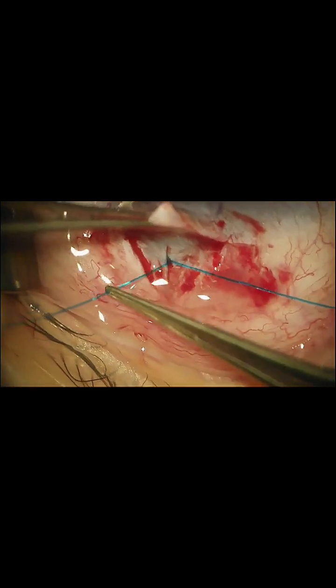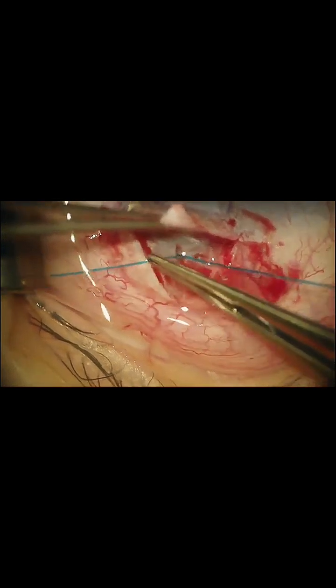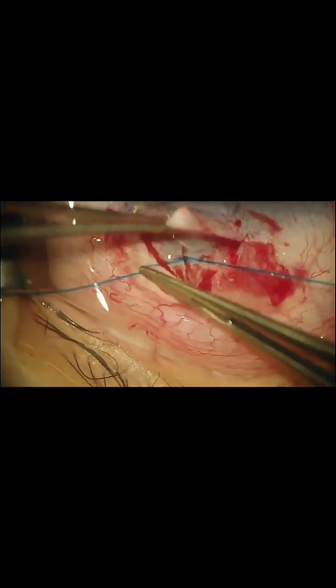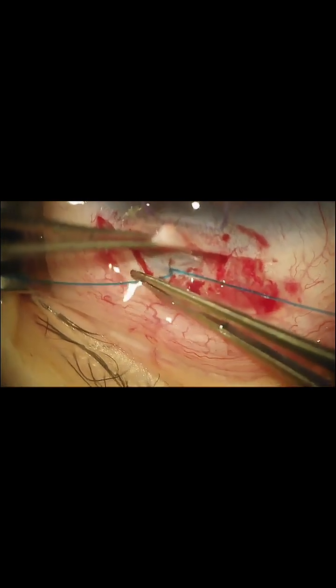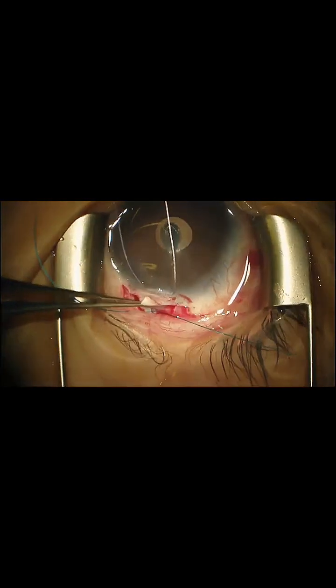So these are not only confirming, but they'll stay there as markers, because if you lose your anterior chamber depth, it's very hard to then find Schlemm's canal. So it's a bit of a way to cheat and keep that place. And it should advance very easy. If it doesn't advance easy, then you have to wonder why. Now I'm going to change the lighting so we can show the anterior chamber better.